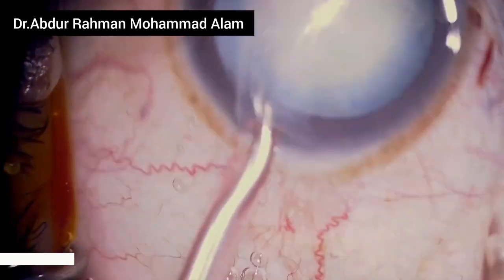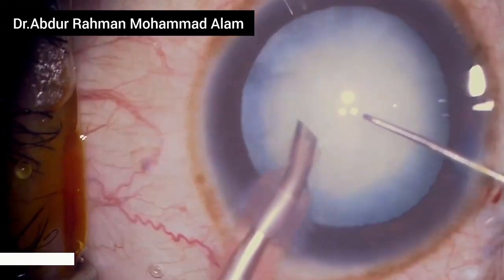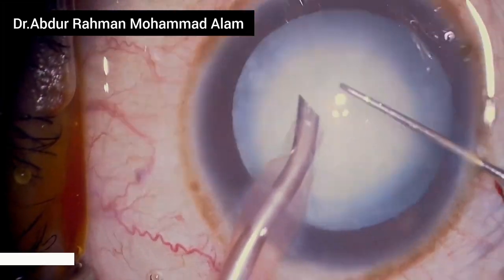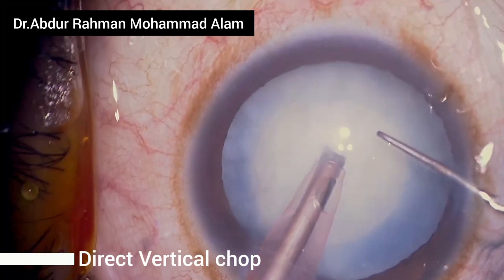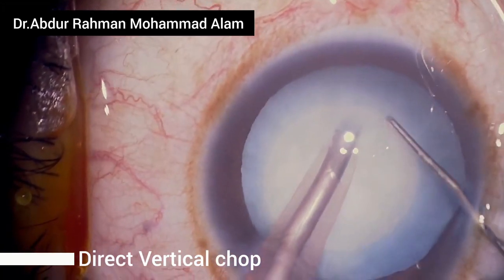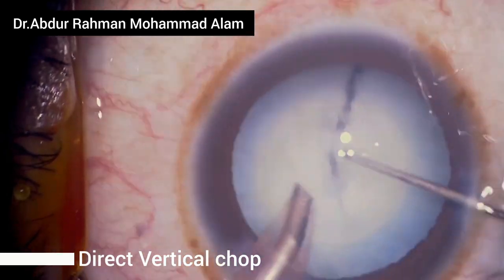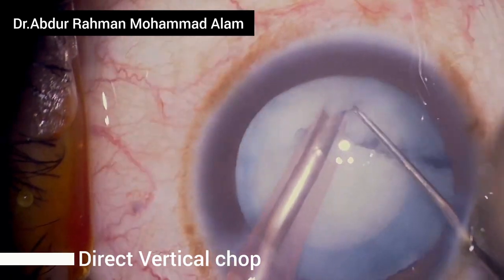Now commence with phaco emulsification. I'm using the Centurion machine to help emulsify this white cataract. I am preferring a direct vertical chop in this soft cataract, and I have successfully chopped a quadrant.